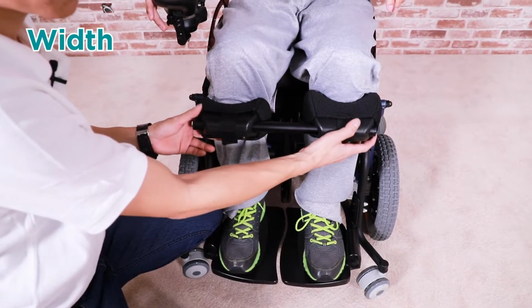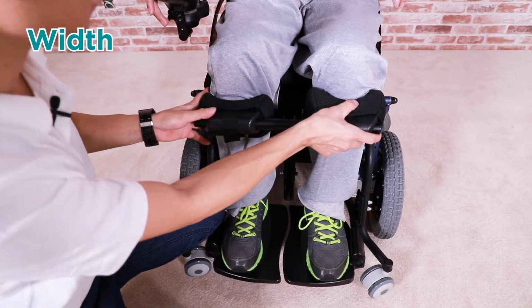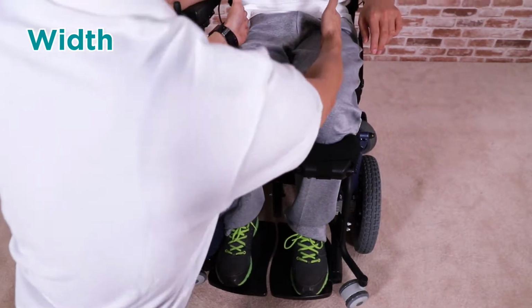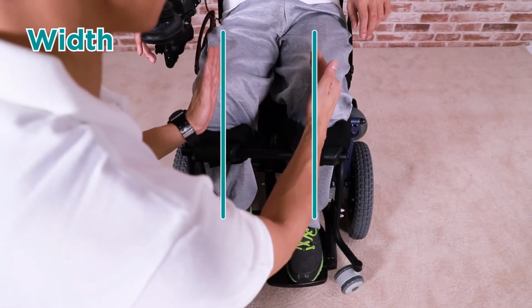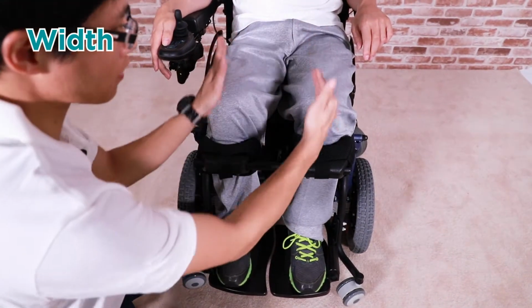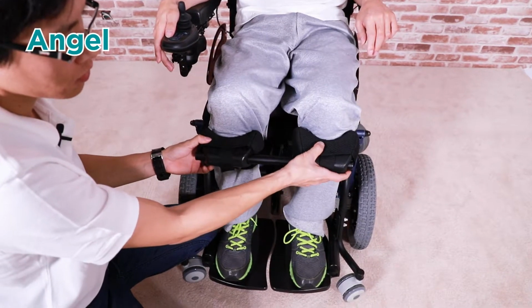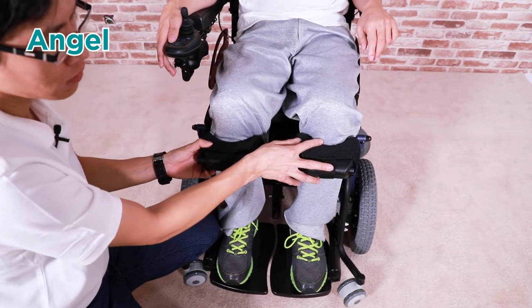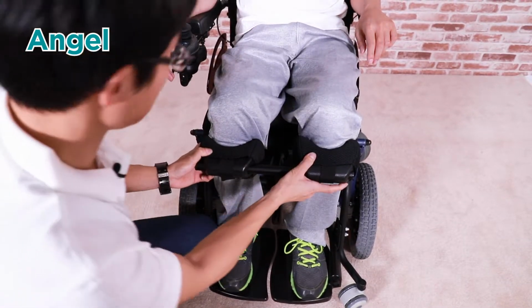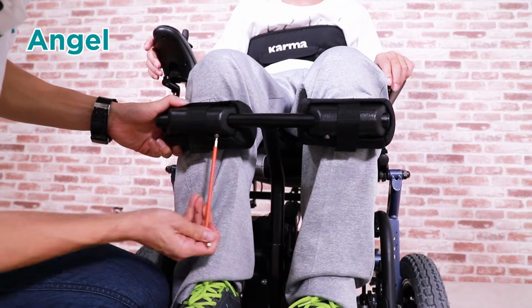Now, we adjust the width and the angle of the knee pads. The width is quite easy. Just draw a line from the user's thigh all the way to his shin. We want to align the pads with this line. With the angle, we want to find the angle of the pad that provides the maximum contact to the leg. Okay, now we tighten up the bolts from both sides.